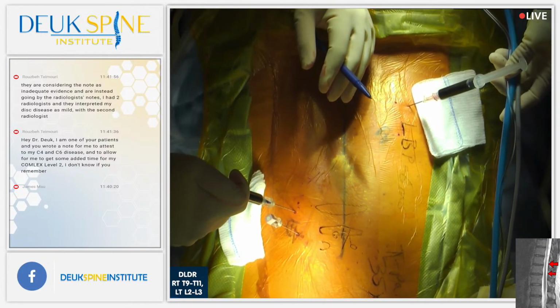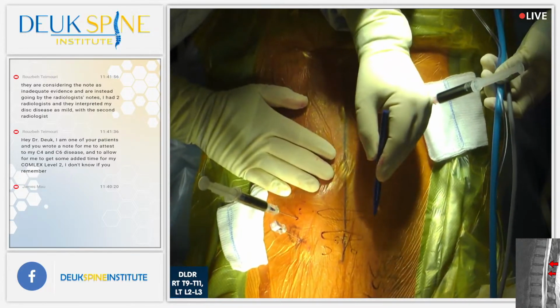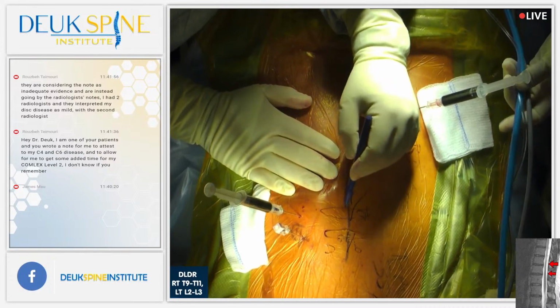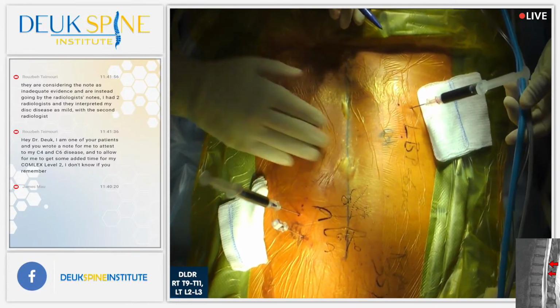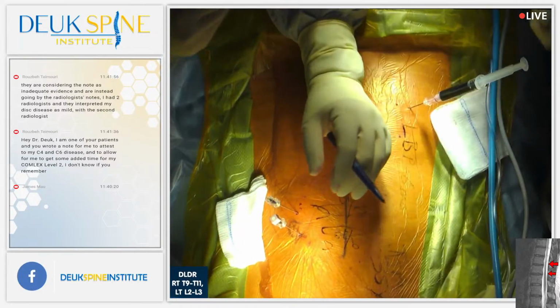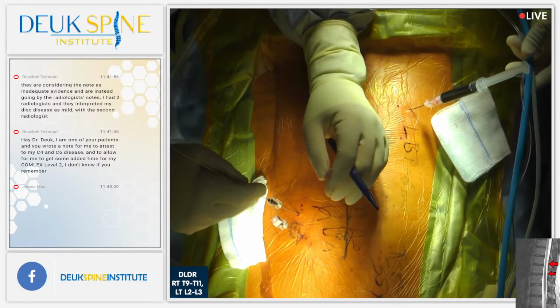How bad is that on a scale of 1 to 10? 10? Is that where you get pain typically? Congratulations, we found the second spot. That's the number T10-11, concordant. All right, easy, Tiger. You're good. We're going to put you to sleep in about 30 seconds. Okay? 30 seconds, you'll be asleep.